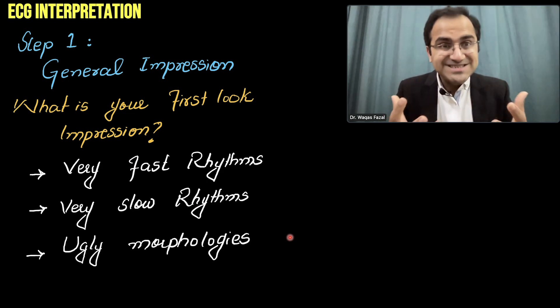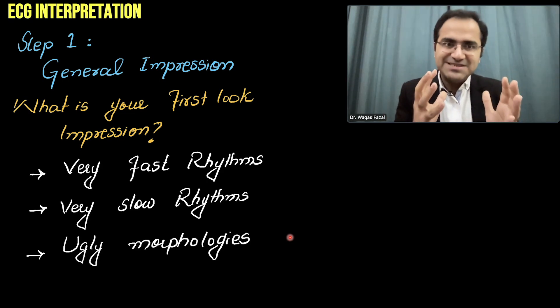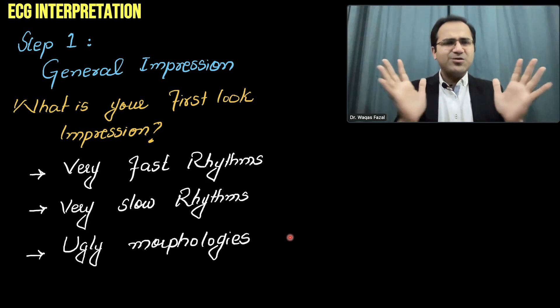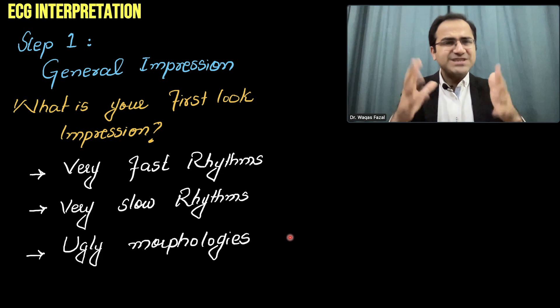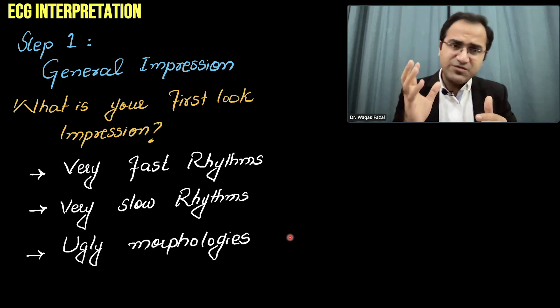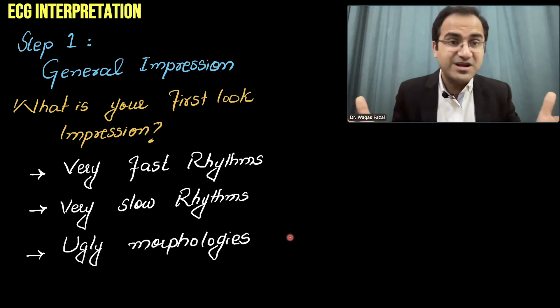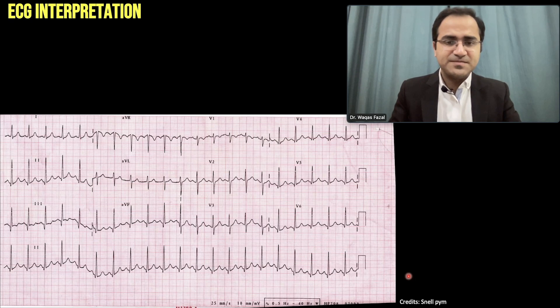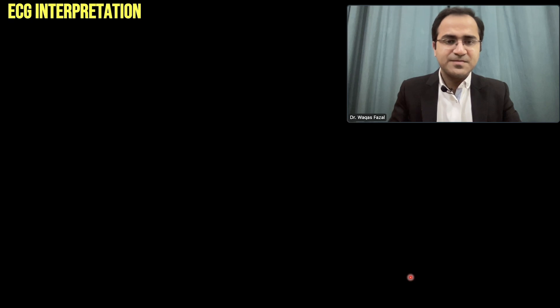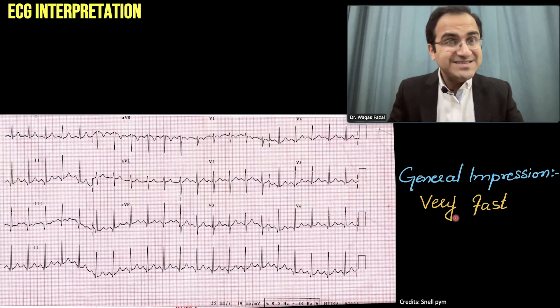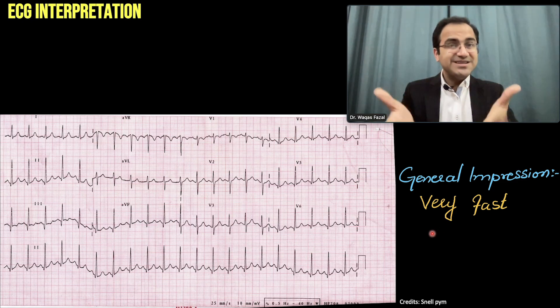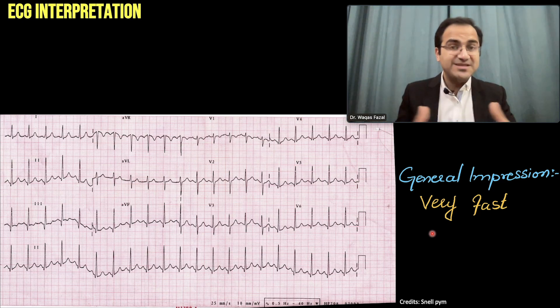I will show you some ECGs for 3-4 seconds and you have to take a general impression from each. You do not need to calculate rates, rhythms, or anything — you just get a general impression of whether it is a fast rhythm, a slow rhythm, or there are ugly morphologies. Looking at the first ECG: your general impression should be that it is a very fast ECG — the rate is very rapid, the rate is very high.